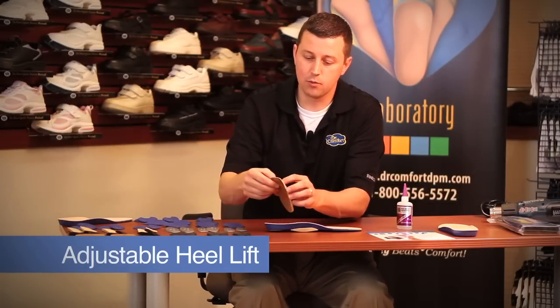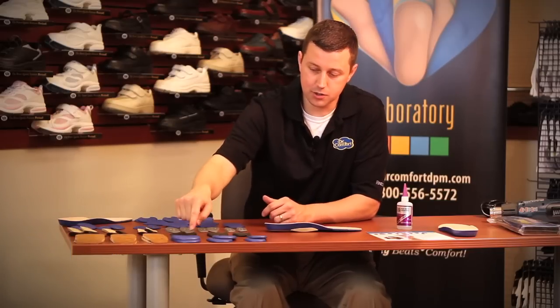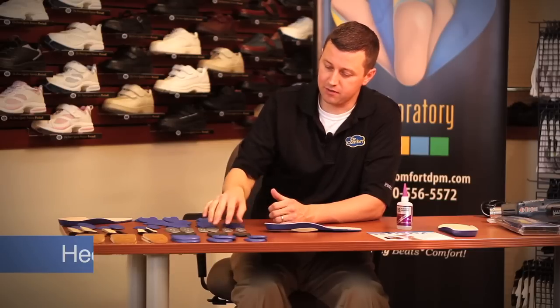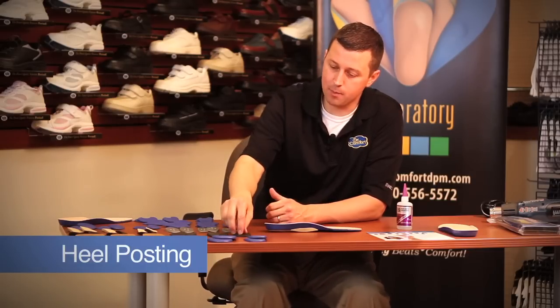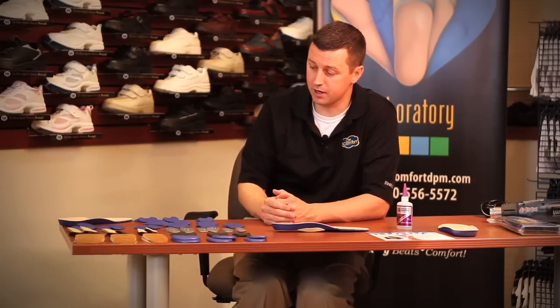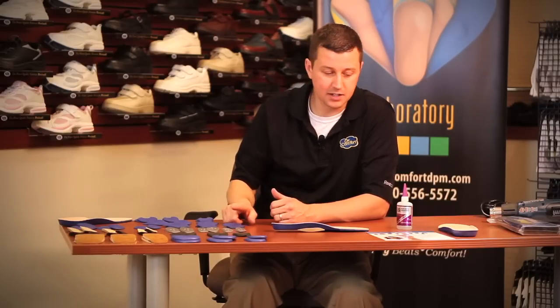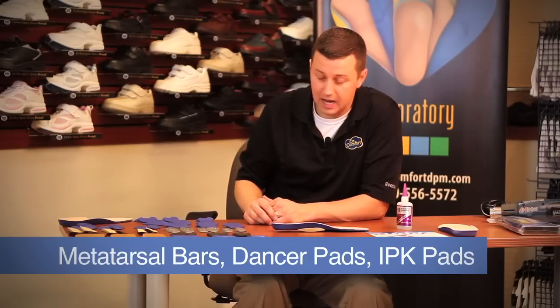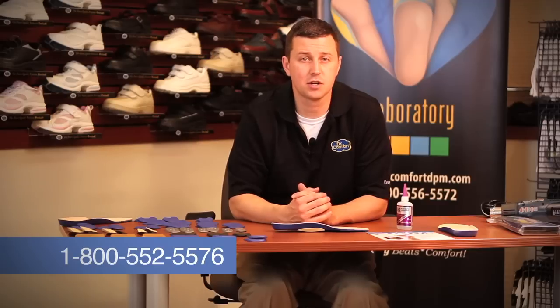Additional pedorthic modification pads include an adjustable heel lift with removable layers for different heights, a sponge heel pad for cushioning support, and heel posting options including a PVC heel post and a rubber heel post. We also have metatarsal pads in small, medium, and large to offload forefoot deformities, as well as metatarsal bars, dancer pads, and IPK pads to assist with offloading different areas of the foot. If you have any questions regarding any of these tools or would like to order them, please don't hesitate to call our customer service or any of our certified pedorthists on staff at Dr. Comfort. Thank you.